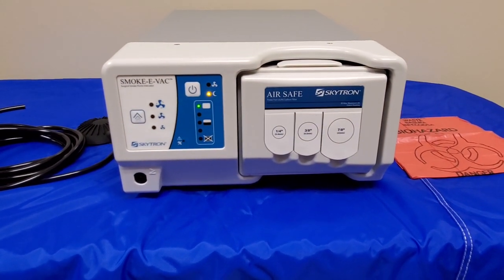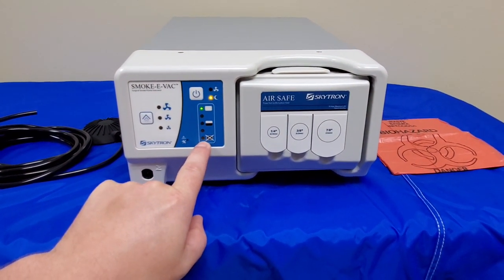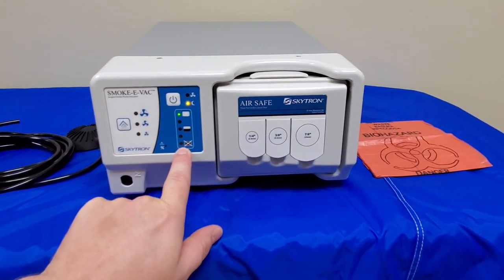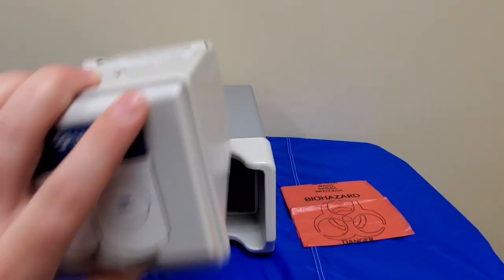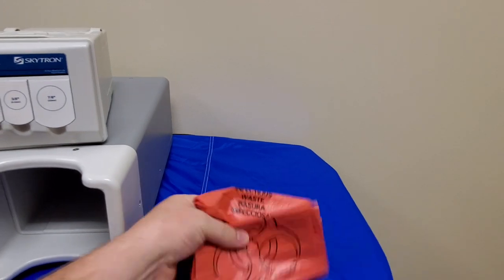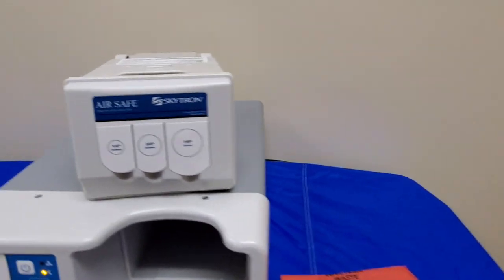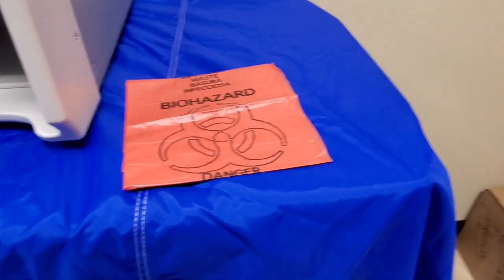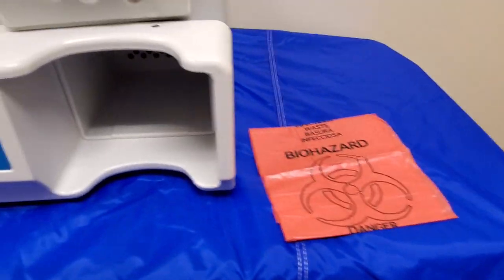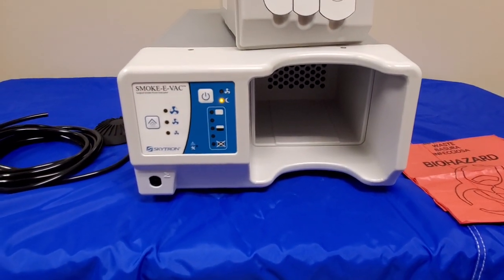There's just one more thing I want you guys to know. When your filter gets down and the unit will no longer turn on, you have to dispose of this filter properly. You're going to grip it, pull it out, and you're going to use the included biohazard bag because this filter is going to be full of some disgusting stuff. Place it in the biohazard bag, dispose of it properly, install your new filter, and you're ready to rock and roll.